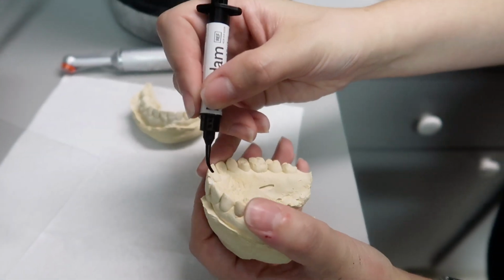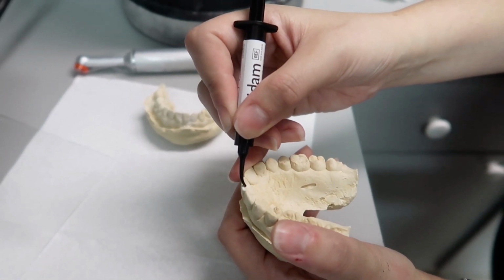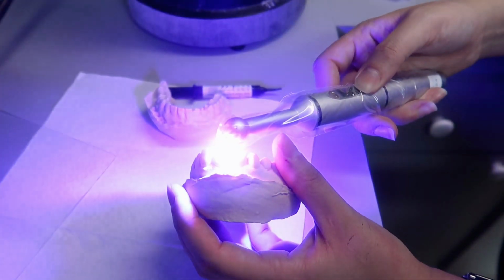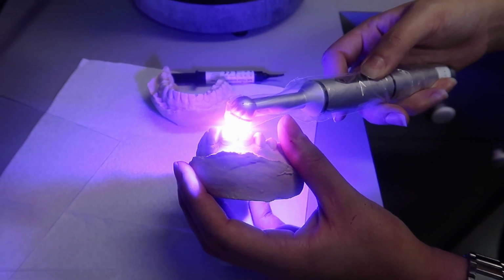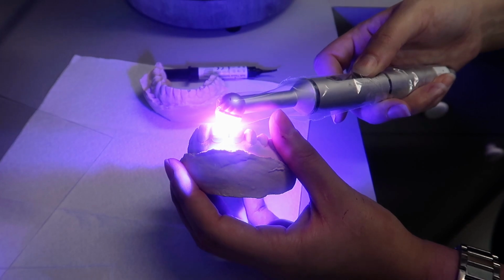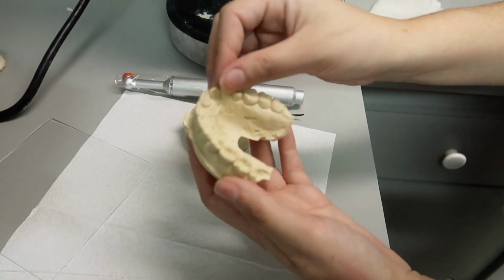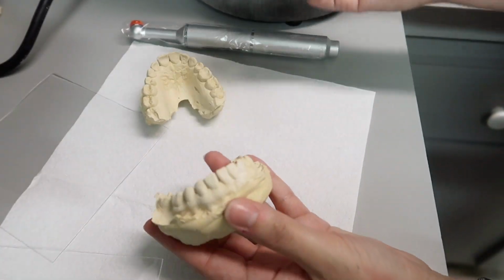And if you don't have liquid, then maybe some expired flow. Yeah, that works. I know some people do it with wax, but honestly, I think wax, it's not manageable. It gets kind of weird to mess. Yeah, I just don't like wax. So I think that's the only one really we have to fix on the upper. So let's go ahead and work on the lower.